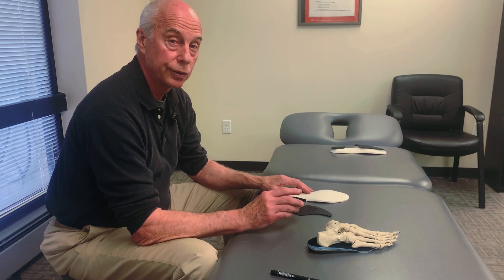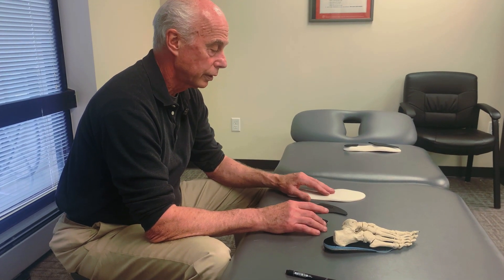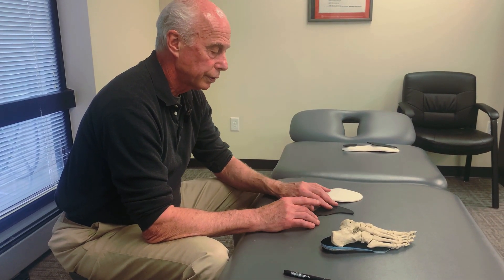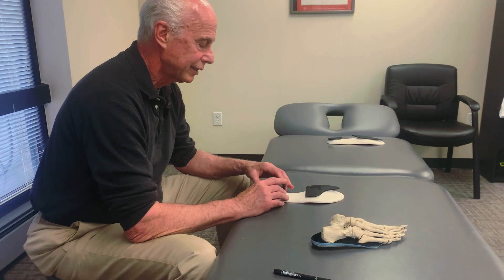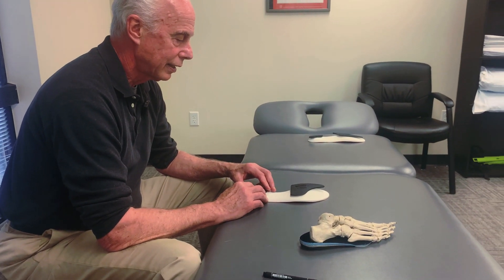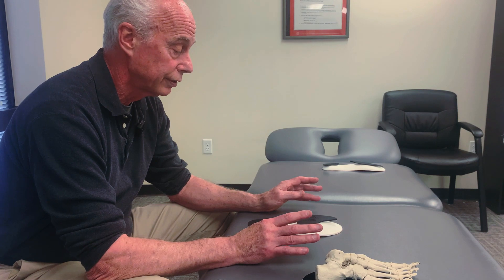There's a video on how to use the peel-and-stick varus posts. I'll also go over how to use the valgus posts as well, but the varus posts were designed to take the place of an orthotic. Orthotics for people who pronate are incredibly effective — patient satisfaction rates are really high with them.